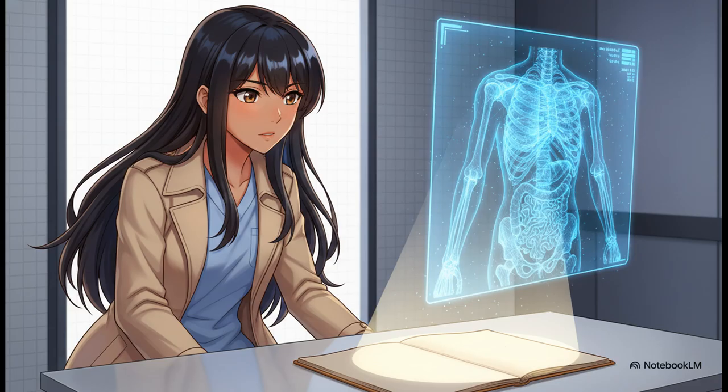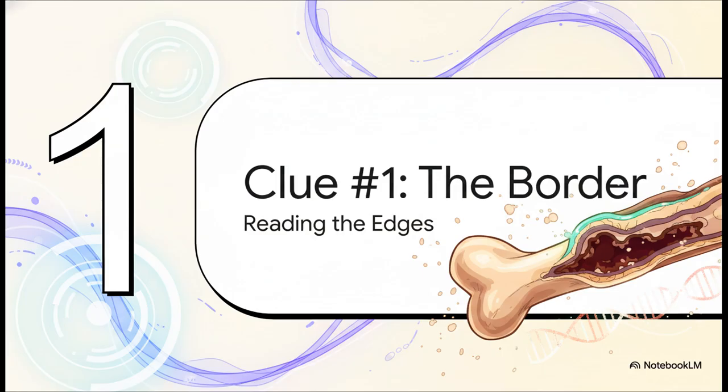Well, according to our source material, the entire investigation hinges on one single critical question. Is this lesion aggressive? That one answer guides every single thing that comes next. So let's open up the case file and see how they figure it out. Our very first piece of evidence is found at the perimeter of that shadow. We're talking about the border, or what radiologists call the zone of transition. This is the line in the sand where the lesion meets normal, healthy bone.